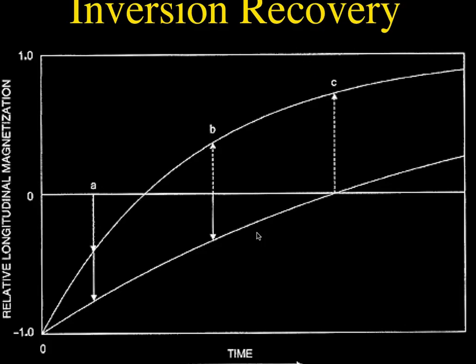Now, inversion recovery, the STIR sequence, is another sequence that can suppress fat. We've already talked about this a couple of times. If you do an inversion pulse and then wait for the spins to recover along the z-axis, if you wait a short amount of time, the fat will have recovered up to zero. If you then do your 90 and 180 degree pulses, there's no z component of the bulk magnetization vector for fat at that point, and so it will give no signal. There's a lot of z component of the bulk magnetization vector for the other components like water here, so they'll be rotated into the XY plane, will spin around and give a signal.